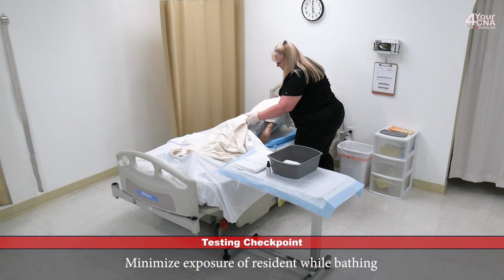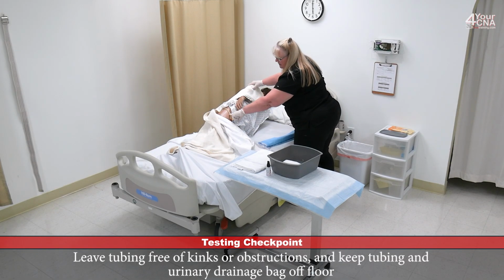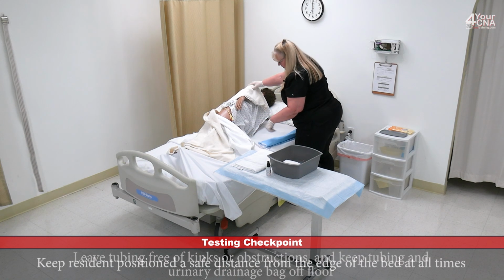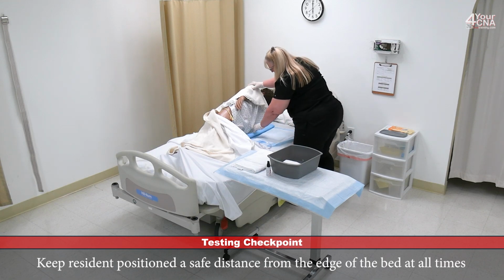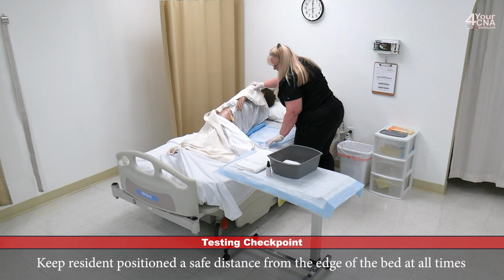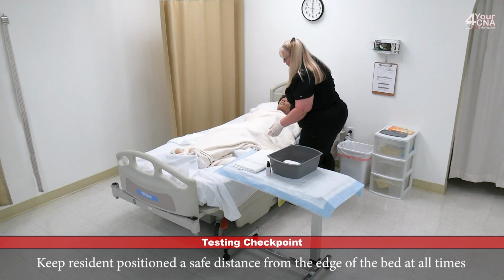1, 2, 3. And as I roll the patient, I want to be careful not to put any stress on this catheter or the tubing. You don't want it pulling tight. So I'm going to unroll the chucks underneath the patient and tuck it under her hip. Miss Jones, come on back. And scoot to the middle of the bed, please.